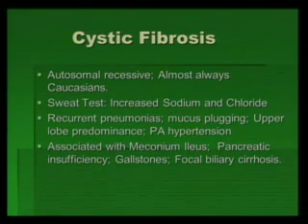So if you have a newborn, a brand new baby was born, and they do a KUB, and you see free air, you see calcifications all over the peritoneum, you might see ascites, that's meconium peritonitis. That means in utero, the baby perforated the small bowel, and it could be due to meconium ileus. Meconium ileus is when the meconium gets so thick it blocks the ileocecal valve, and so you cause a small bowel obstruction and the small bowel perforates. Meconium goes in the peritoneum, it causes the peritonitis, and meconium ileus is associated with cystic fibrosis. It could be due to jejunal atresia, ileal atresia, but if you have meconium ileus, they could have cystic fibrosis.